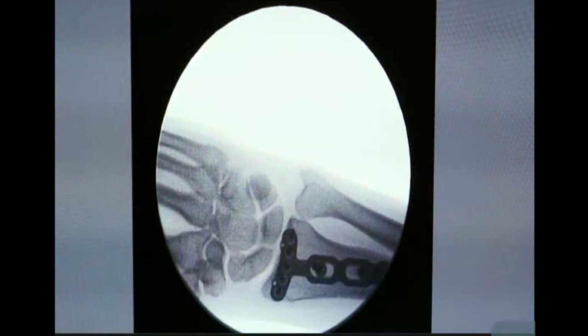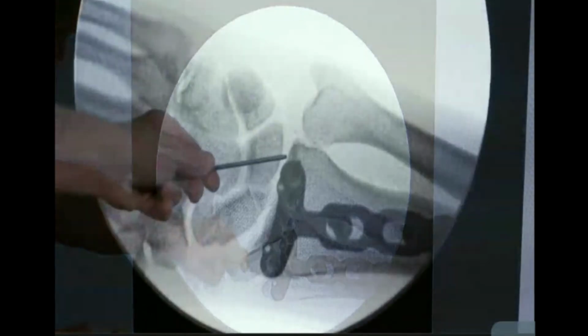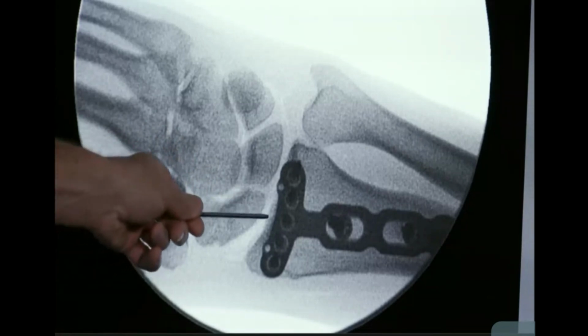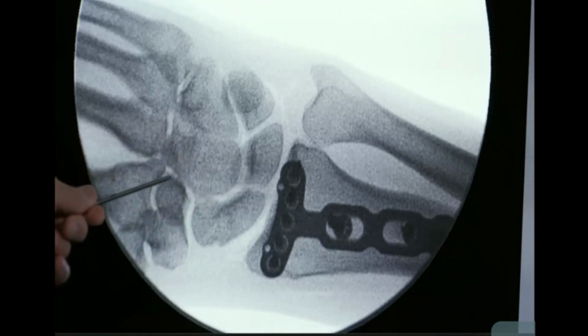So the first thing about dorsal plating we know is we are so much closer to the joint than we're used to with volar plating that sometimes these plates will look like they are above and into the joint. But we need to remember that the dorsal lip comes out distally a fair amount. And surgically, we were right here looking at this bone. So we know this plate is not prominent, not riding over the joint.